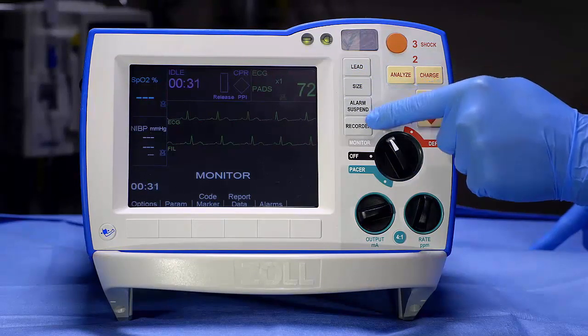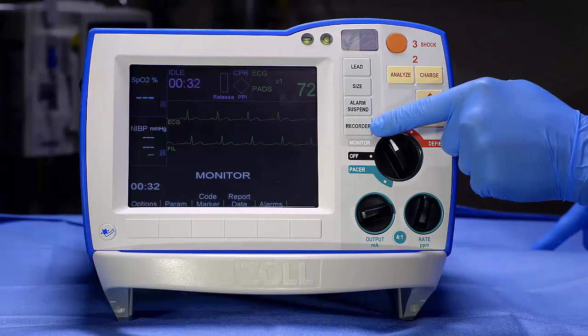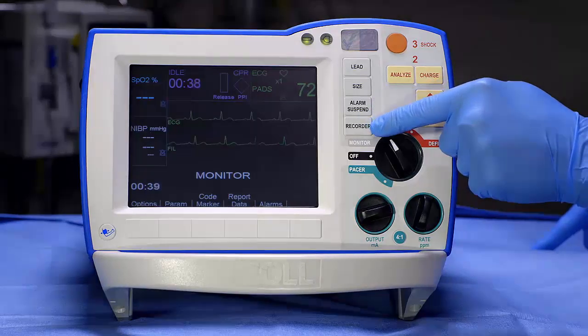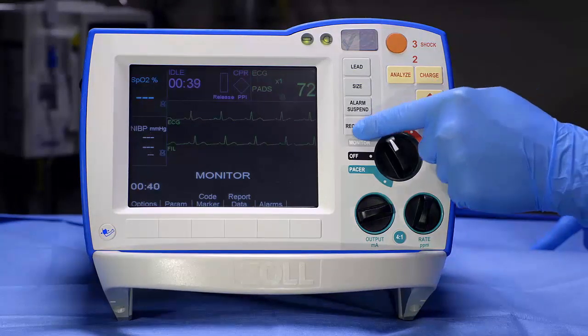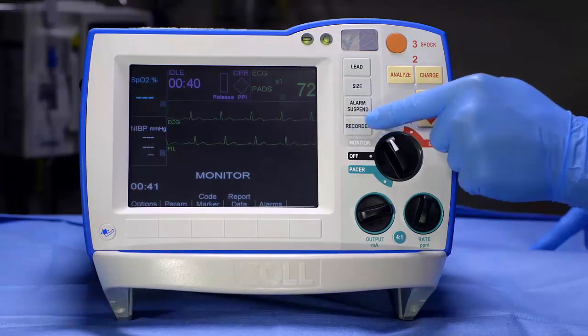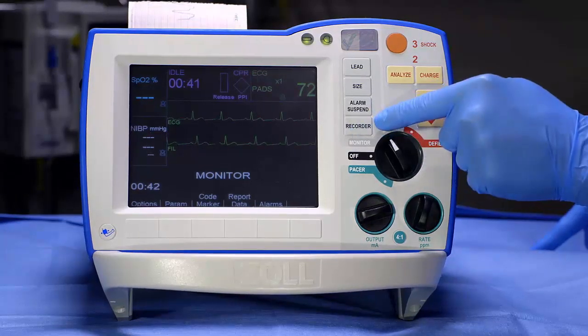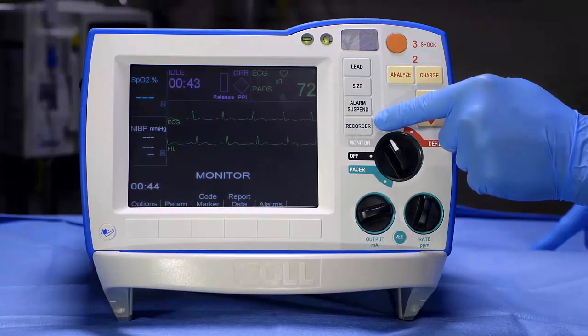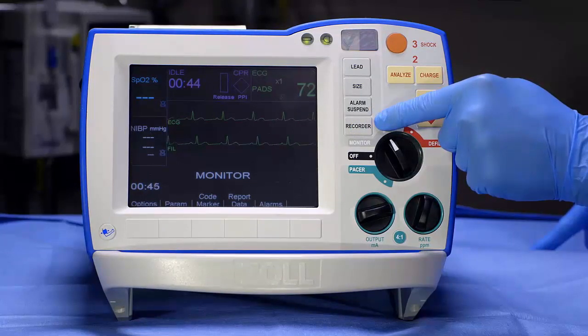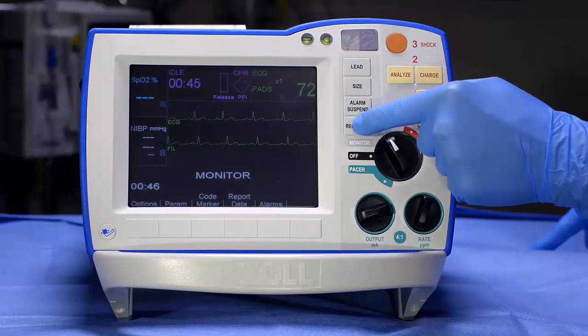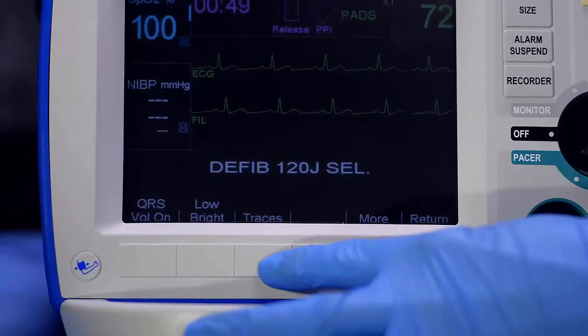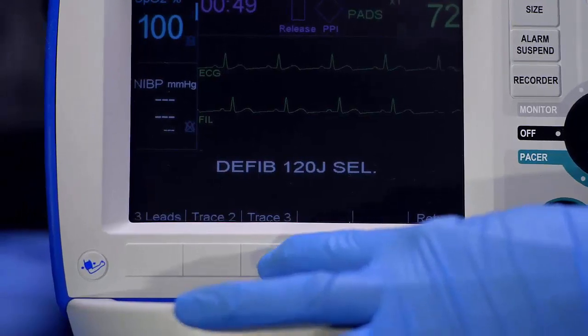The Recorder button stops and starts the strip chart recorder whenever it is pushed. A strip chart automatically prints whenever there is a critical event or a shock is delivered.